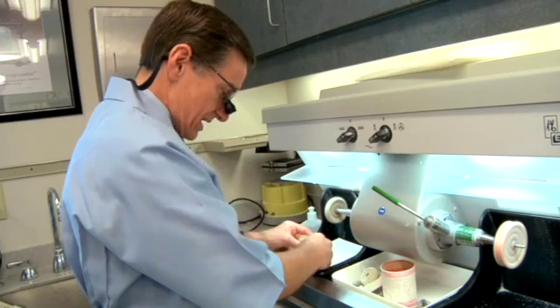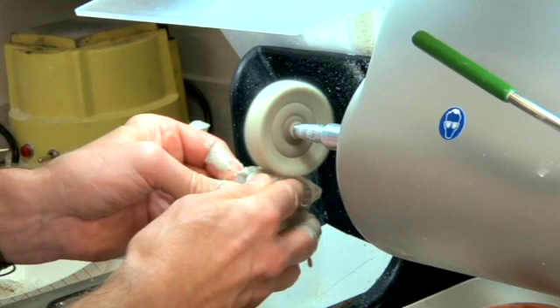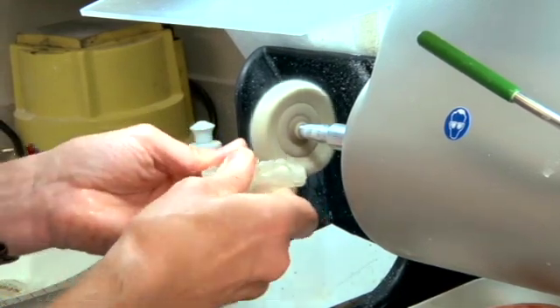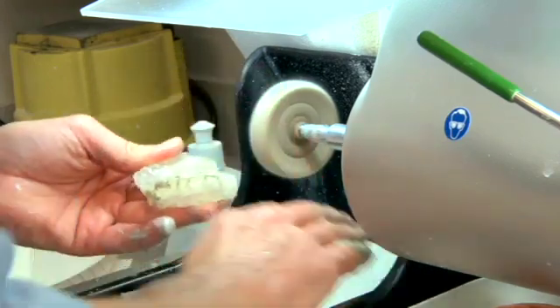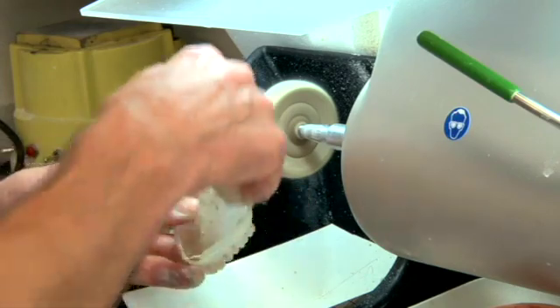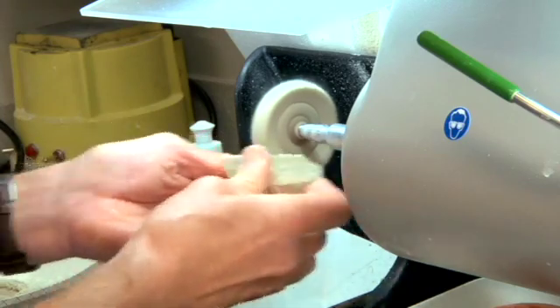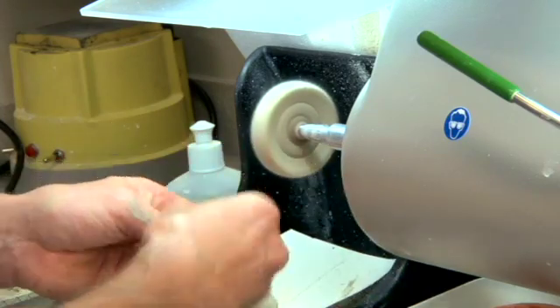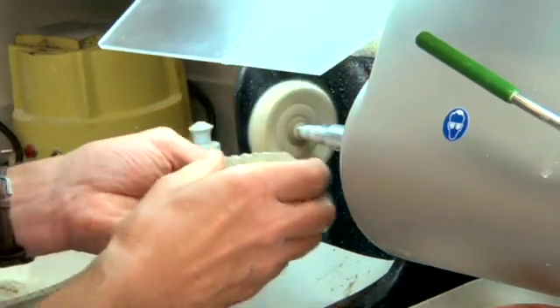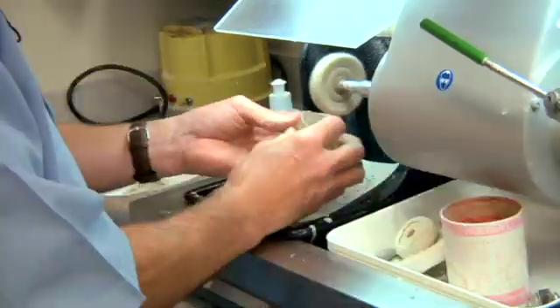First one I'm going to polish is the clear duplicate. You'll notice I'm going to put a little pumice on here. I'm going to polish the labial surface and the borders. I've got my wheel turning this way against or with my border, so if I did it the other way, it would grind back my border. This way, it's just going to feather it down. I'm going to keep some pumice on there. I'll work my way around the side.